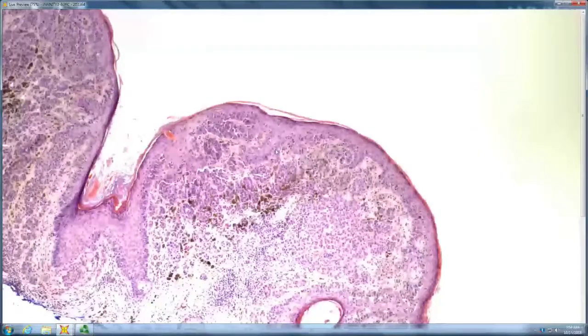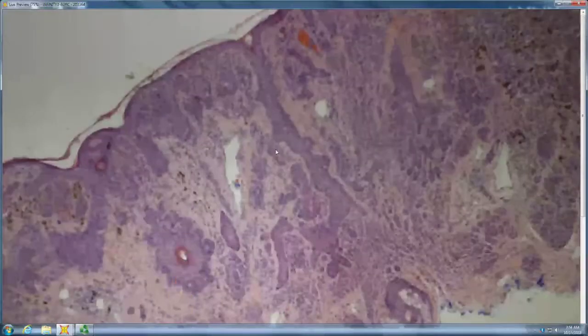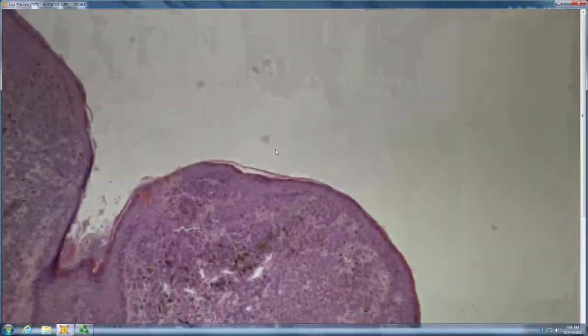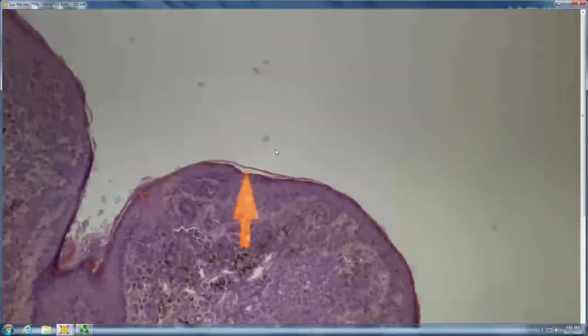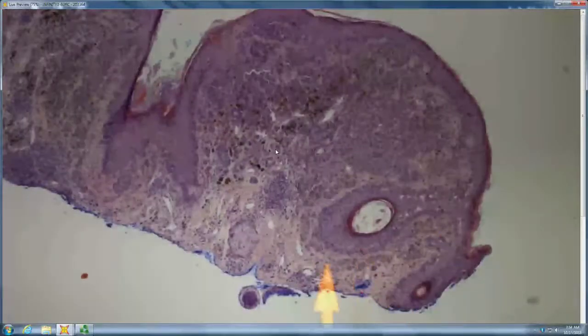So first off, you have the ordinary looking nevus over here. It gives you bilateral asymmetry at scan. There's asymmetry of pigment, asymmetry of the epithelial component. This population neither matures nor disperses. It runs along the adnexal structures.